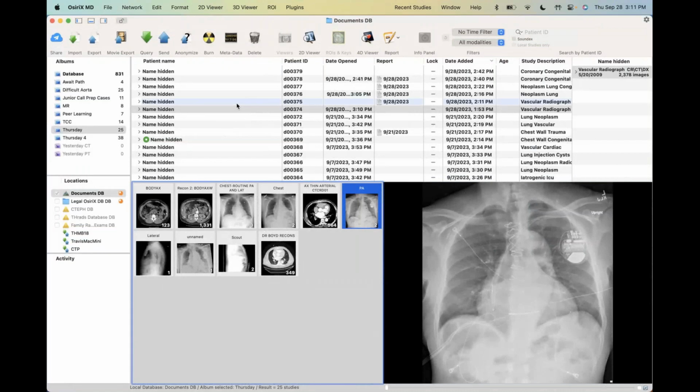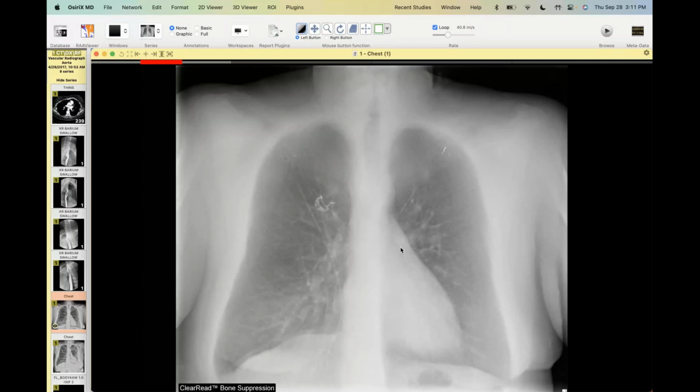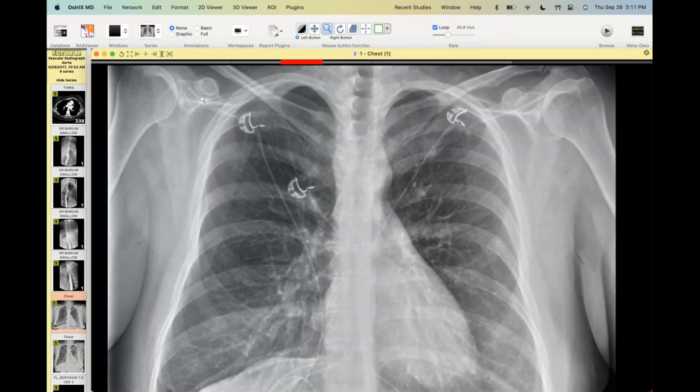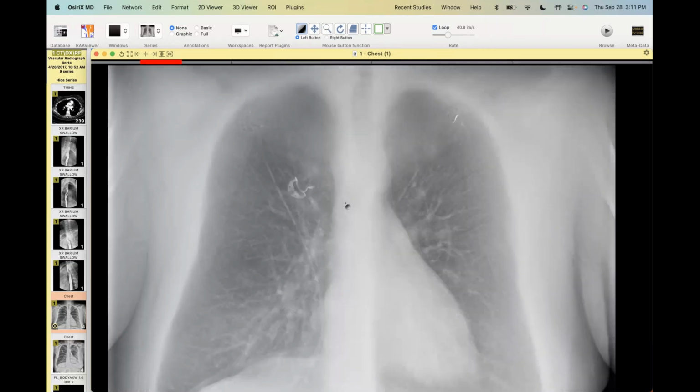This one, it's more the story that's always interesting in these patients. Like this, I can't remember, I think 27 is how old this patient was at the time. And you can see a left-sided aortic arch, but you also notice an indentation on the right side of the trachea as well, and a fullness here in the right paratracheal space.